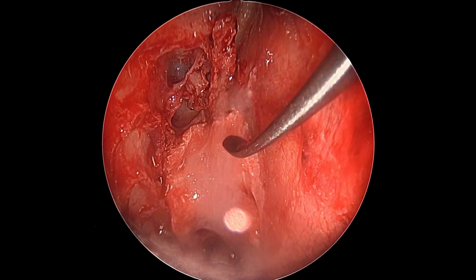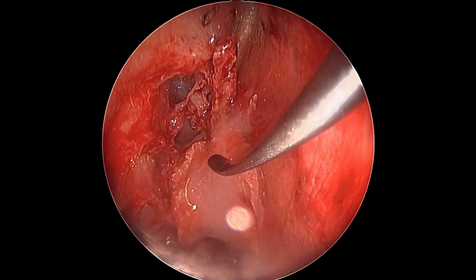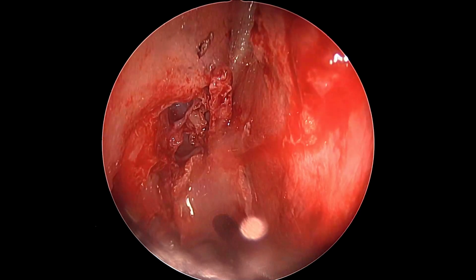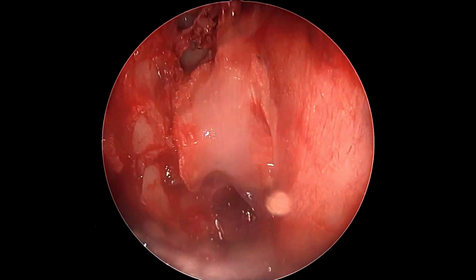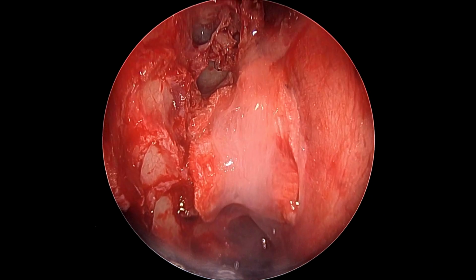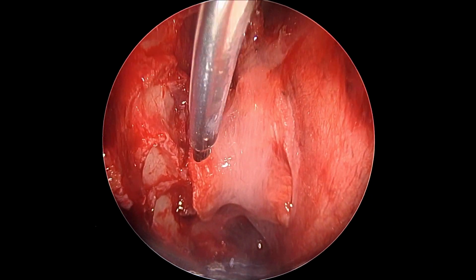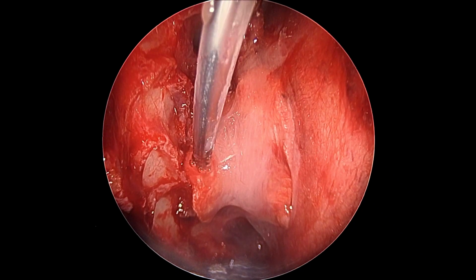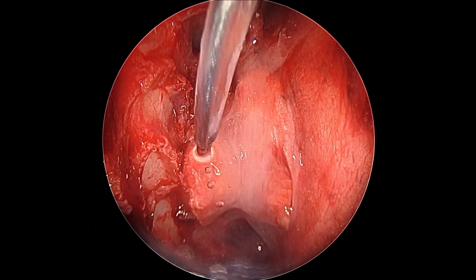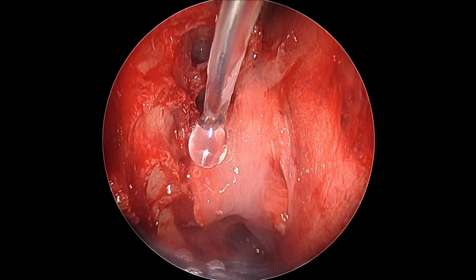So we just give a few minutes for this tissue glue to act and to make a sort of a soft seal over our defect, over our repair of the fascia, and as we can see here, it seems to be reasonably placed. It's not moving and is well spread out. So along the edges we can maybe place a little bit more tissue glue for it to get fully secured in place.